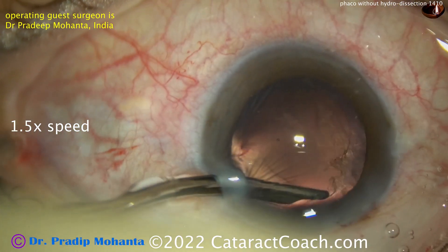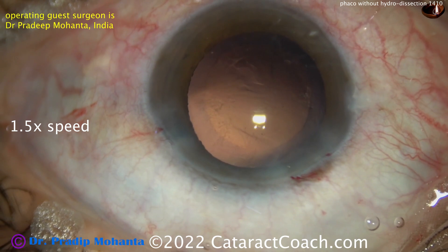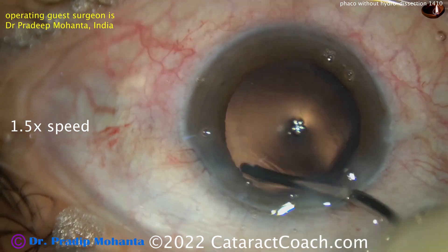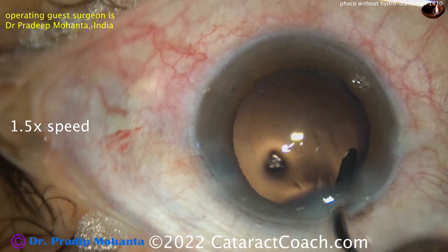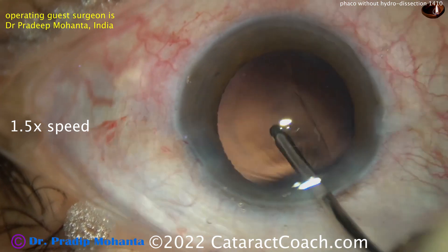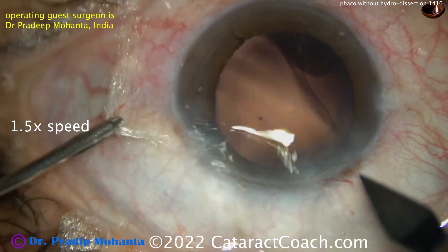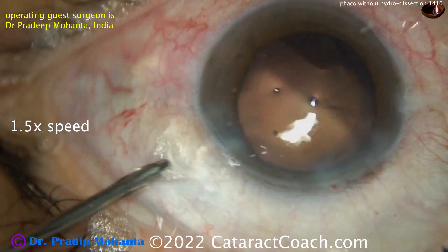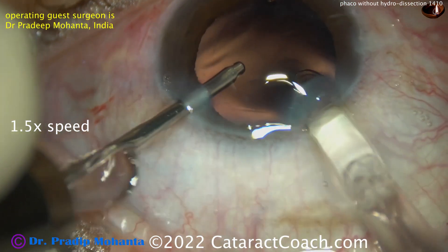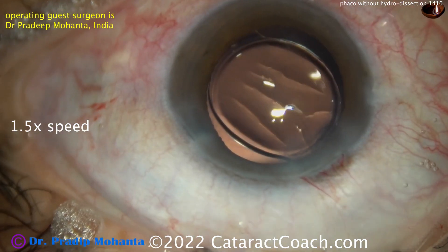A little capsule polishing if desired, and then the new lens can be implanted. The paracenteses are a little larger, so he goes in through the side port to remove the subincisional lens cortex as well. At the end of the case, everything is cleaned up nicely. He uses HPMC — hydroxypropyl methylcellulose — commonly available in the USA as OcuCoat from Bausch & Lomb. He performs hydro-implantation using the infusion port in the left hand to keep the eye inflated, so no viscoelastic is needed in the bag. A single-piece acrylic lens is delivered into the capsular bag.